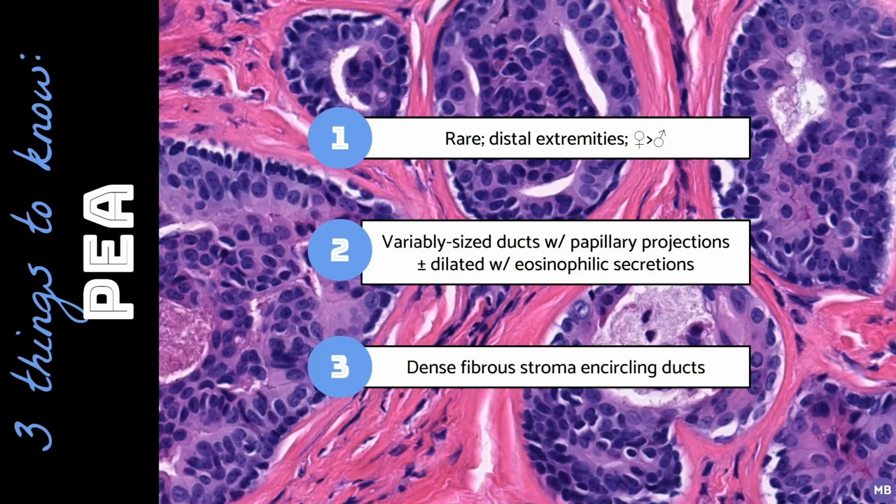Digital papillary adenocarcinoma is also an important consideration. These lesions are usually composed of larger nodules with more architectural complexity and infiltrative growth. In addition, cells have at least mild nuclear atypia, and mitotic figures and necrosis may be present. Clinically, digital papillary adenocarcinoma typically presents as a nodule on the finger of a young adult male.